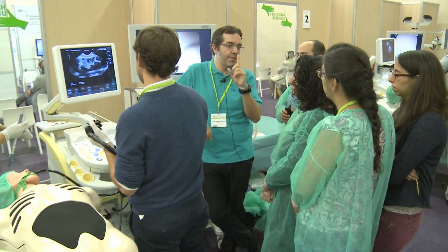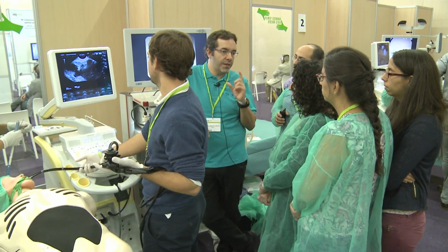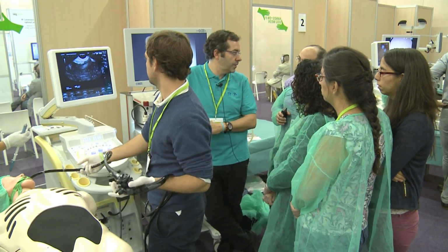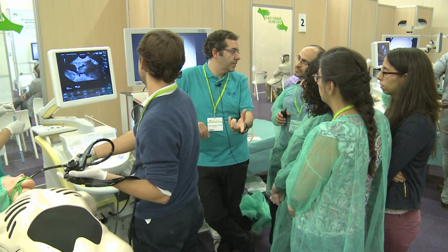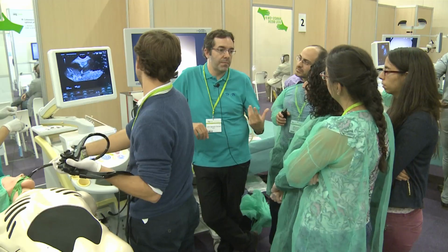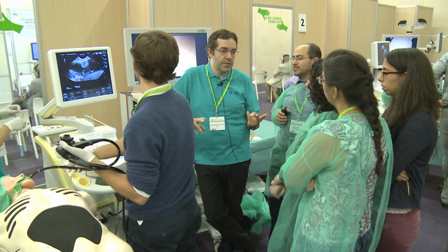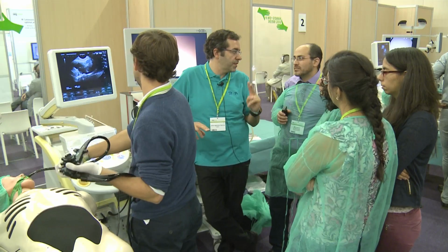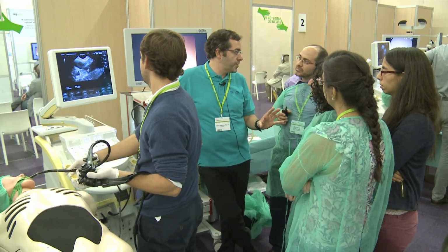I can take the same needle if I first puncture the lymph node and then go to the lesion. But I will never go first to the lesion and then to the lymph node, because if the lymph node is negative, you can make it positive. But in the opposite order, if the FNA of the lymph node is negative and you go to the head of the pancreatic mass, it doesn't matter. Yes, it's always better to use 2 needles, one for each specific site, mainly if it's going to change the treatment of the patient.